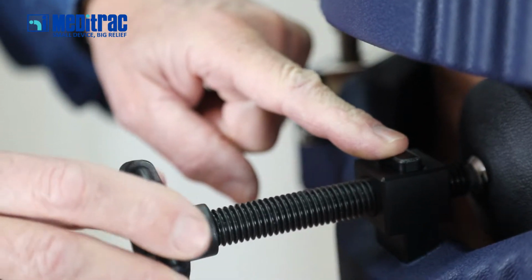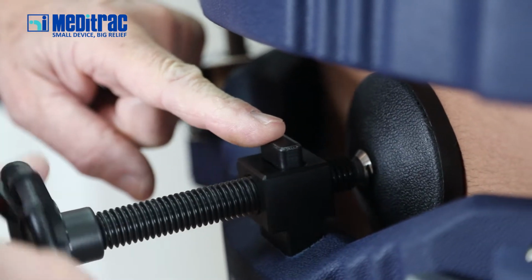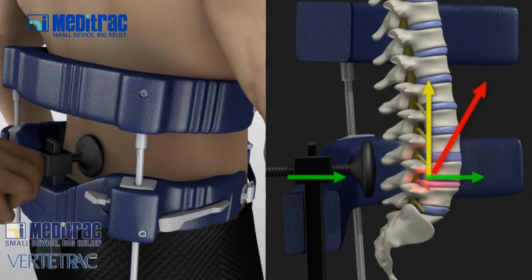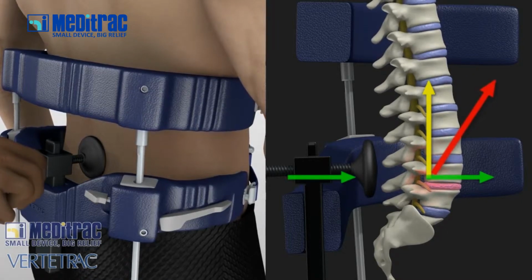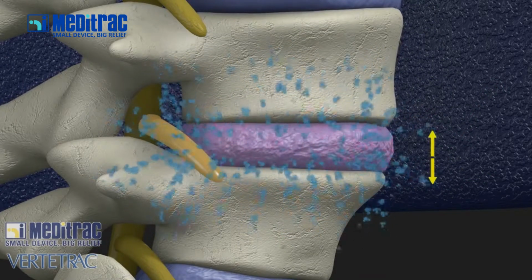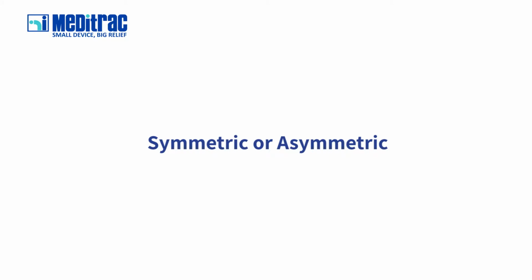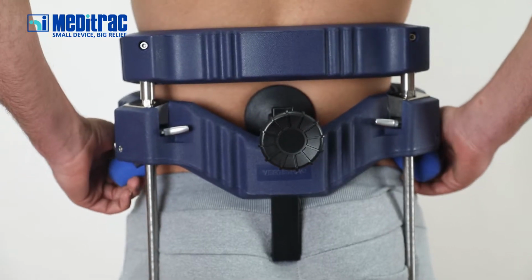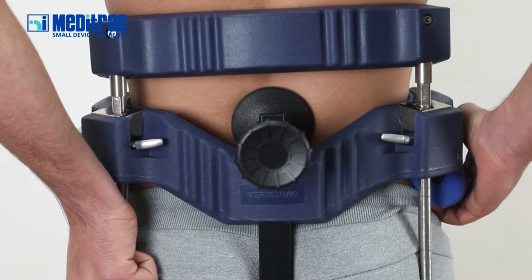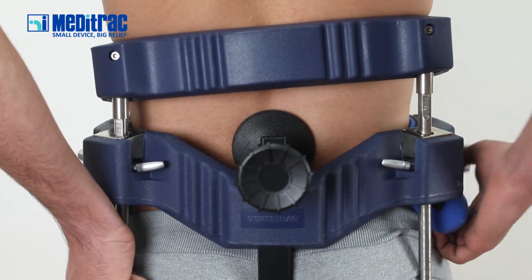When horizontal force is recommended, place and adjust forward the horizontal force pad at the desired level, L3, L4, or L5. Apply horizontal force by turning the horizontal pressure screw clockwise to the point where the patient feels relief from leg pain. When asymmetrical traction is recommended, apply simultaneous traction to the point where the patient feels a moderate traction force and then apply additional traction on the appropriate side.